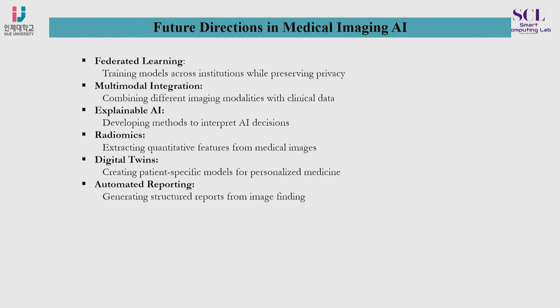For example, in this example, this is a whole slide image, and it will tell the type of this tumor, and also give the detailed information related to this tumor, why it is tumor, how serious it is, and the stages, and different information related to this tumor area, or if it is normal, then why it is normal.